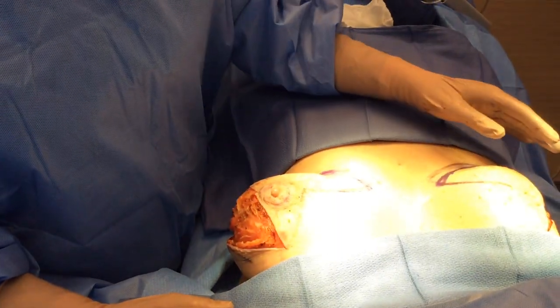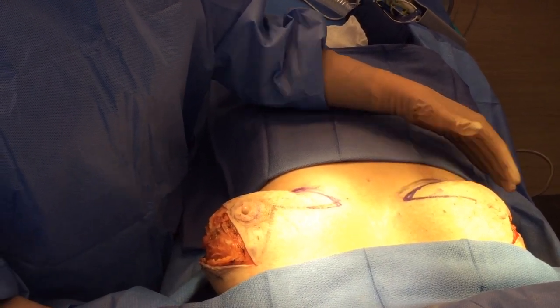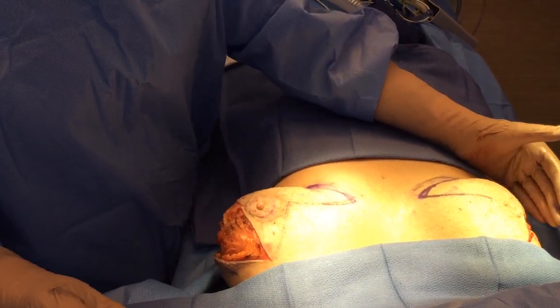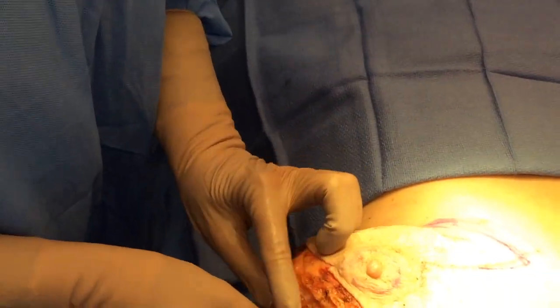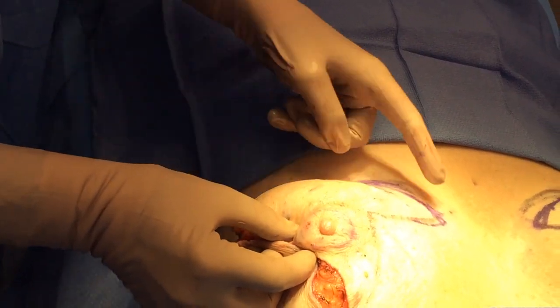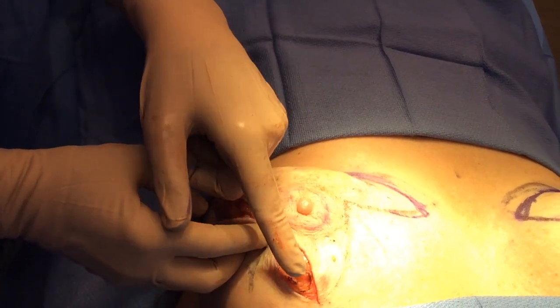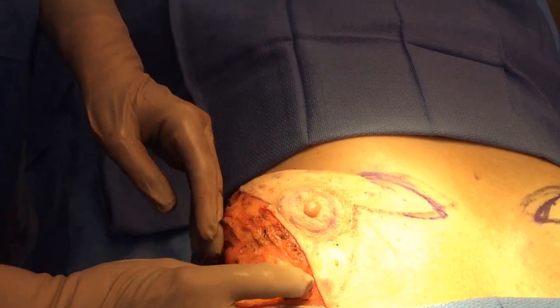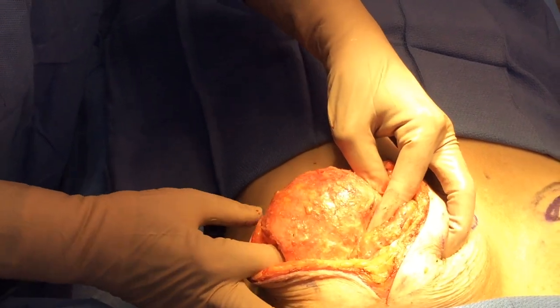I've already done her right side. All these markings you see are for her breast lift. One of the keys in my opinion to this operation is — this breast still has her implant in — but instead of making my incision below and interrupting blood flow to her nipple, I actually just used my lift incisions, created my breast flap, and then I was able to dissect out her entire implant en-bloc with capsule.